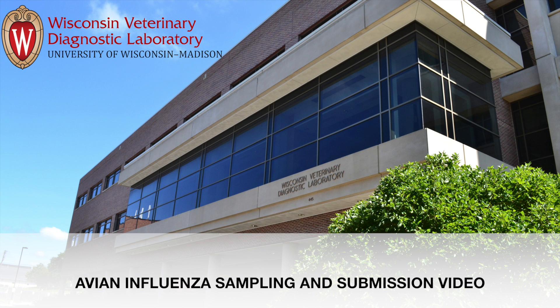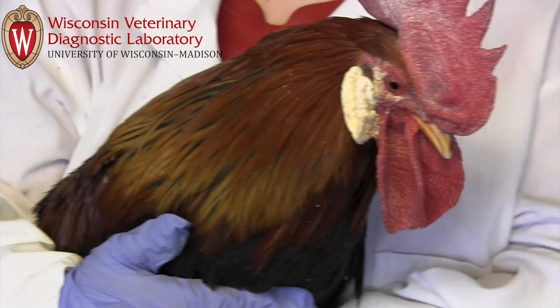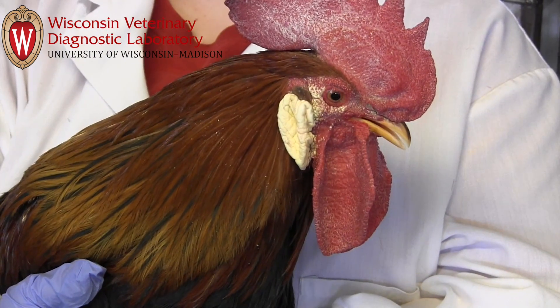This video addresses testing for avian influenza in chickens and other gallinaceous birds, including turkeys, pea fowl, guinea fowl, and game birds such as pheasant and quail. We will cover how to order sampling materials, how to appropriately swab the birds, how to correctly inoculate a tube of broth, and how to return the sample to the Wisconsin Veterinary Diagnostic Lab for testing.